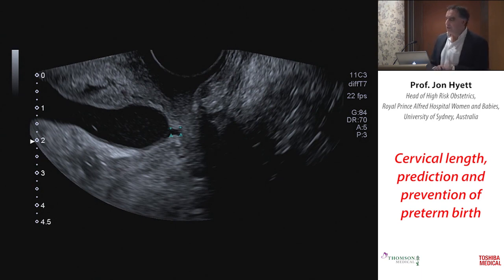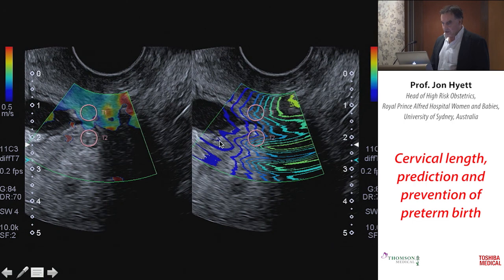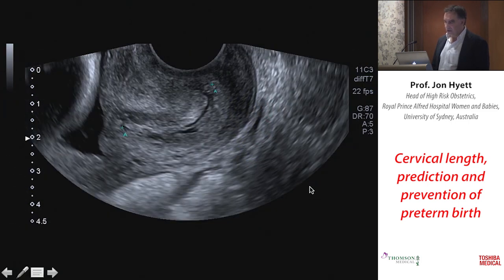There's some situations where it's quite difficult to use this, but you might argue it's not of much added value. So one example here is you can see this is the whole cervix here. The whole canal is dilated. You've actually got a very small remaining closed portion of the cervix here. And this is just doing some elastography on here. You can see that when you get into the other tissues of the vagina and perineum, the waveform's quite chaotic.